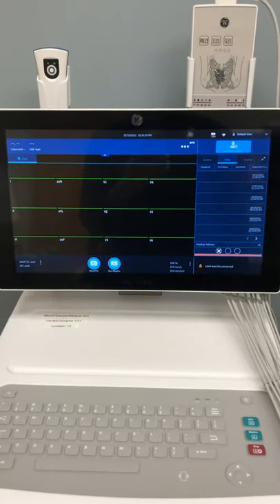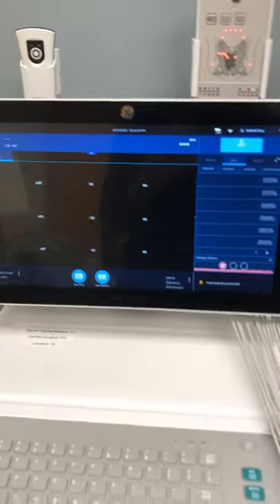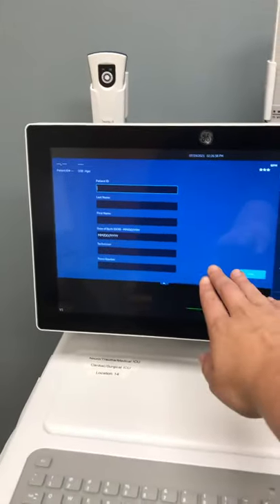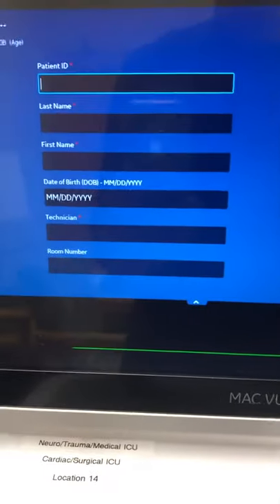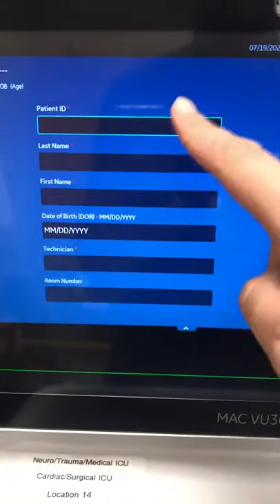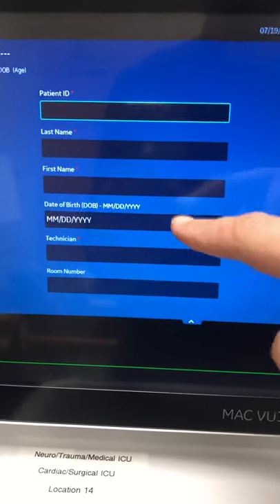Here we have the main screen. To get started, hit Start, and it will drop down all the required patient information. You have to fill out every single field. To start, grab your barcode scanner and scan your patient's wristband — that should populate your patient ID or FIN number, last name, first name, and date of birth.